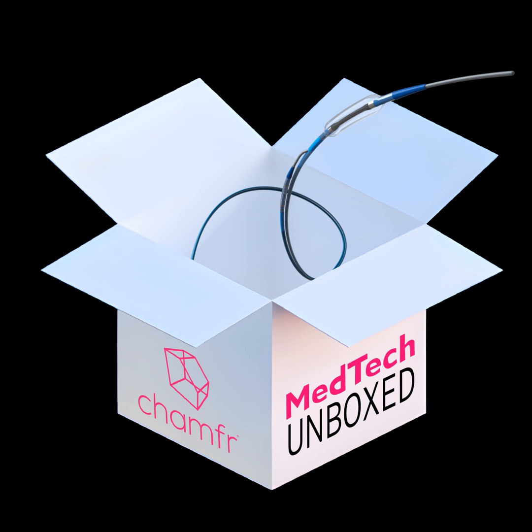Okay. I know you have a pretty solid background in mechanical design and R&D for medical devices, and that's the audience here that's listening in on this podcast today. So you're with your peers. You developed this novel software package to design, develop and simulate delivery systems, reinforced catheters, steerability, all kinds of other features that we'll get into. I was just curious, what was the motivation? Was there a certain point in time or a pain point that you had that you decided to take this on? Yeah, absolutely.